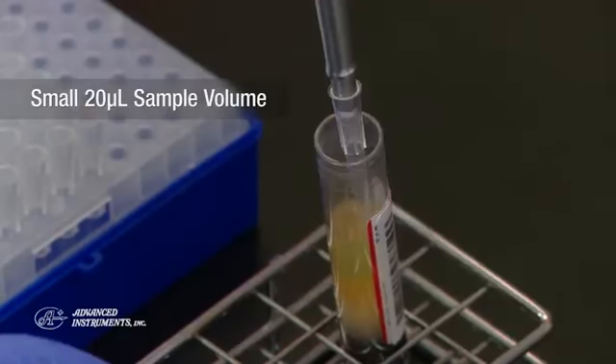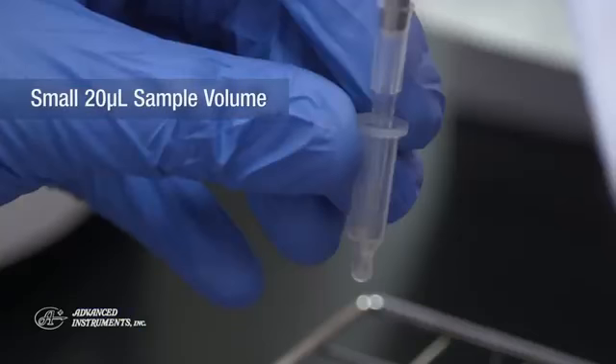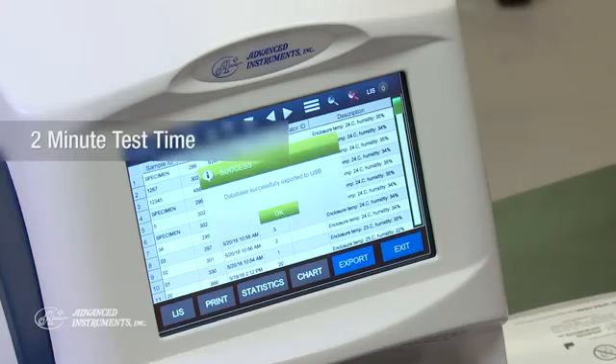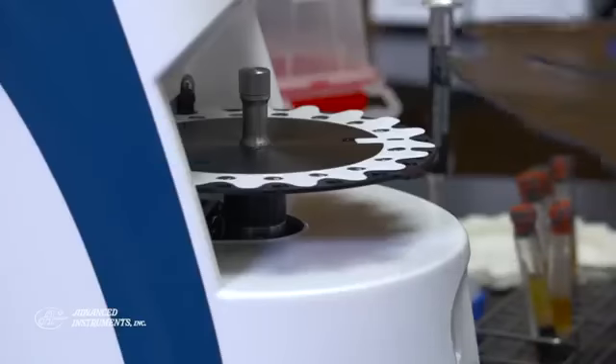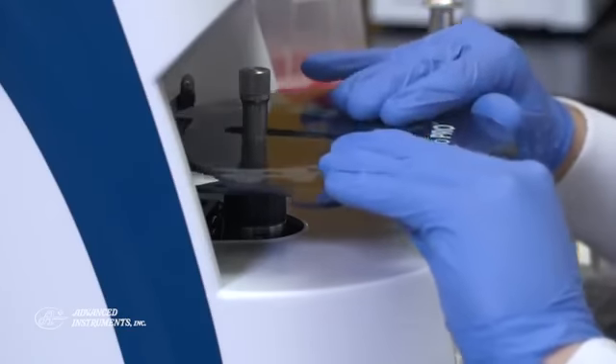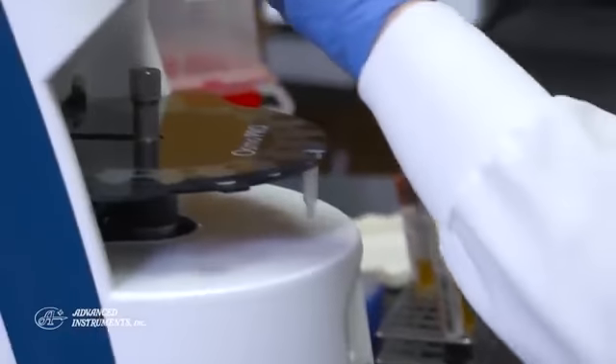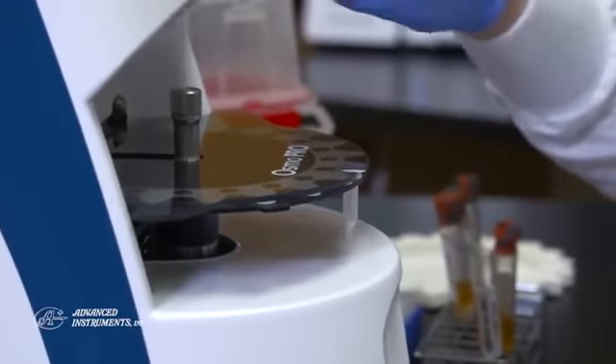OsmoPro uses a small 20-microliter sample volume, which is ideal for sample-limited applications. Results are delivered in two minutes, and the self-cleaning feature ensures the osmometer is always ready for the next test. The carousel can be easily removed to load new samples, or you can add samples directly onto the carousel even as it is running.